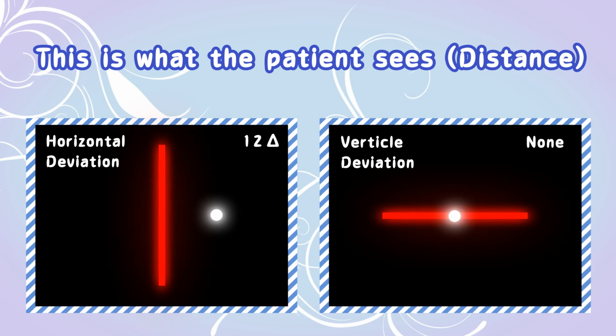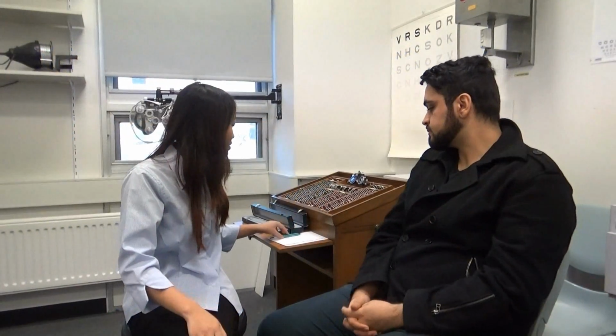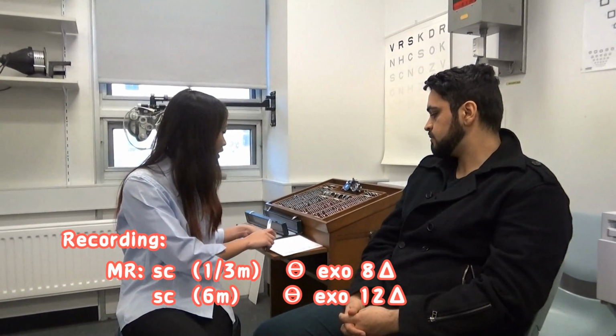Okay, so based on your results, it looks like you have your right eye turned outwards, just slightly though, which is okay. It might be a bit worse in the distance, but only a bit.